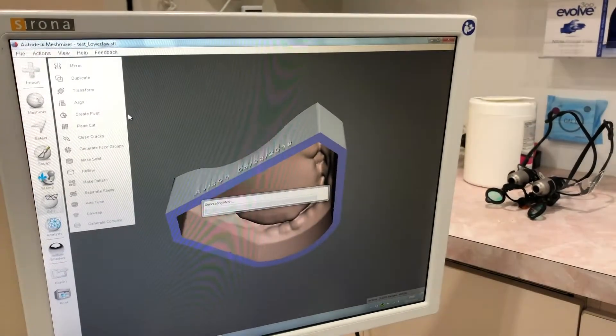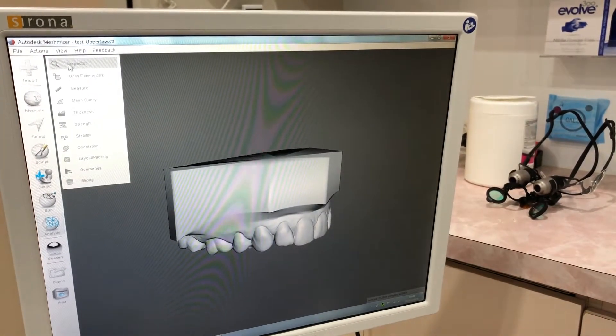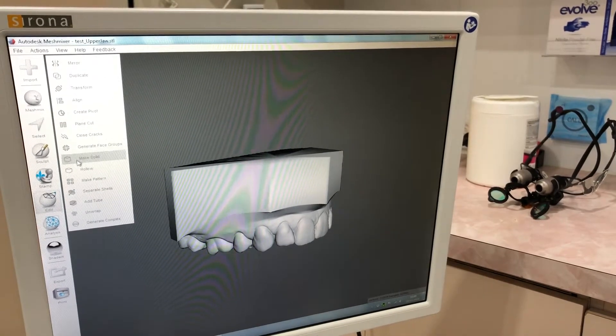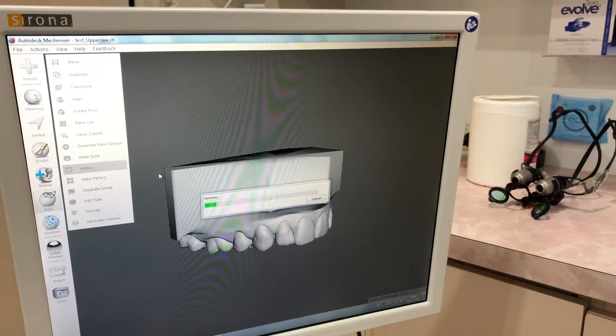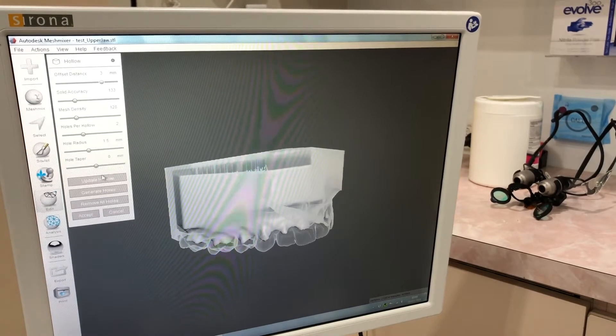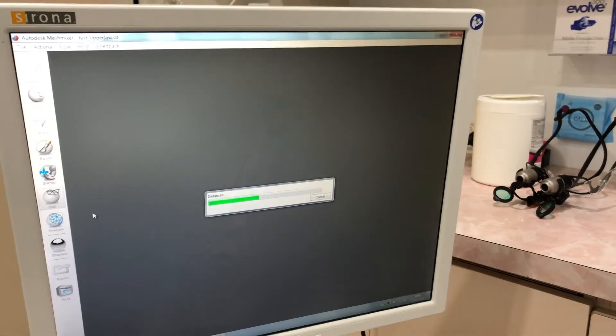Import the opposing model, replacing this model, not appending it. If you append rather than replace, you'll have both models on the screen at the same time, which can be useful in some instances, but not for what we're doing right now. Inspect, analyse, hollow out, and plain cut this in the same way that you did the previous model.